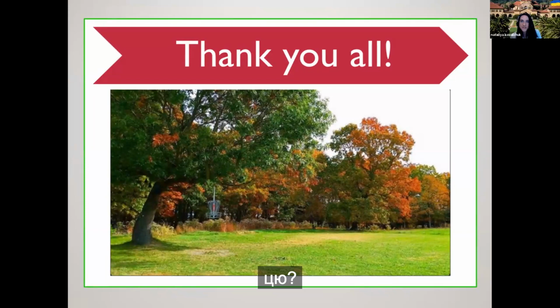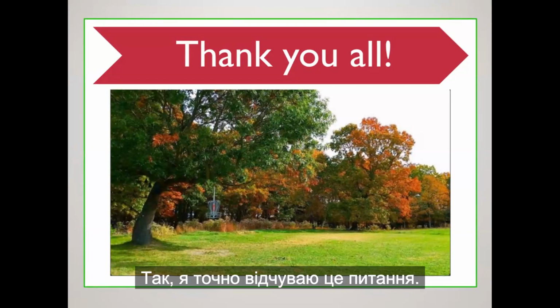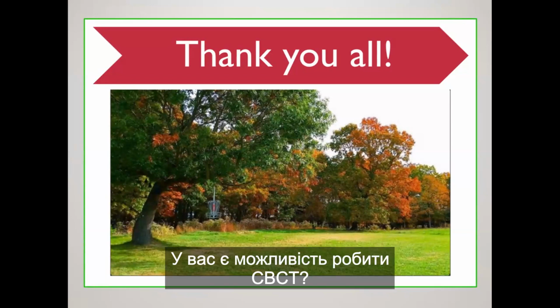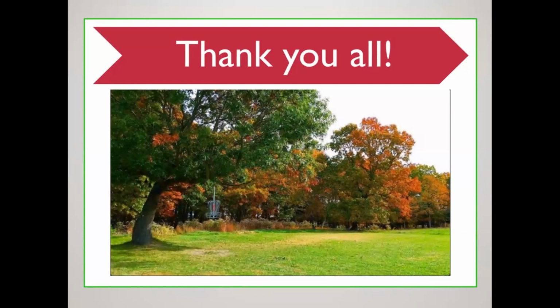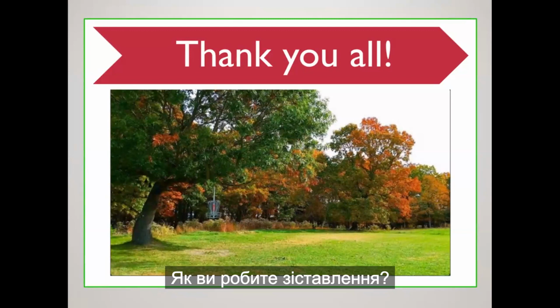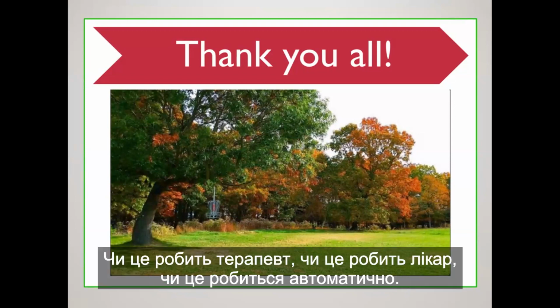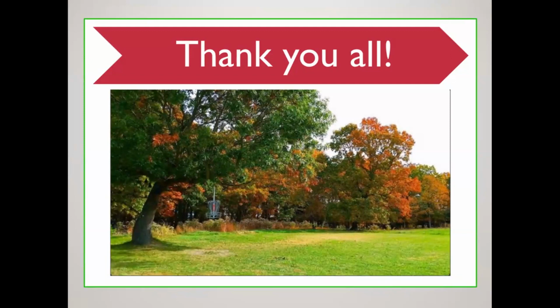Mark, do you want to take that one? Yeah, I can definitely field that question. Do you have capabilities to do cone beam CT? Yes, we do. Okay. How do you do the matching? Is the matching done manually, or is it done by a therapist? Is it done by the doctor? Is it done automatically?